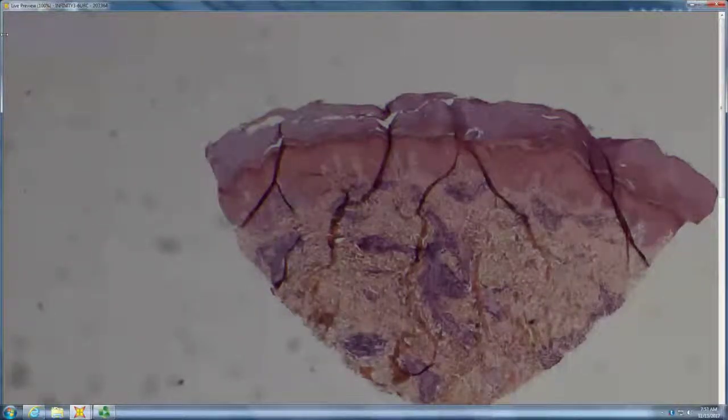And I don't see a lot of papillary dermal edema, but it's certainly a neutrophilic infiltrate, and this patient was on Neupogen. Okay. So it's just a G-CSF type reaction.